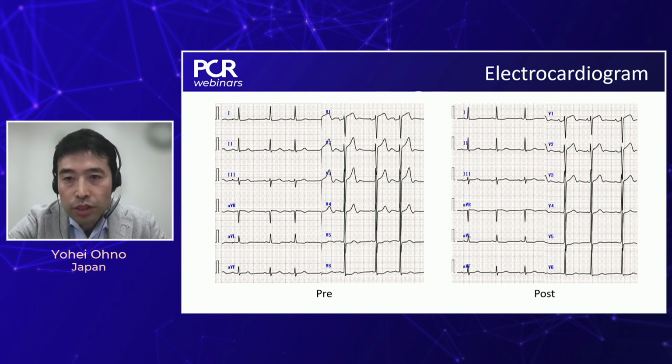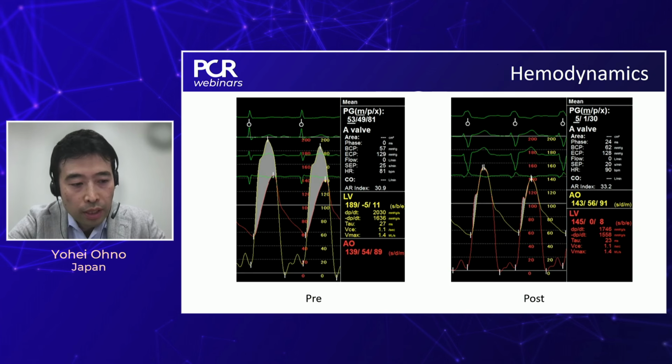There was no new onset conduction disturbance, narrow QRS, nice electrocardiogram pre and post. As for the hemodynamics, this is the invasive hemodynamics.